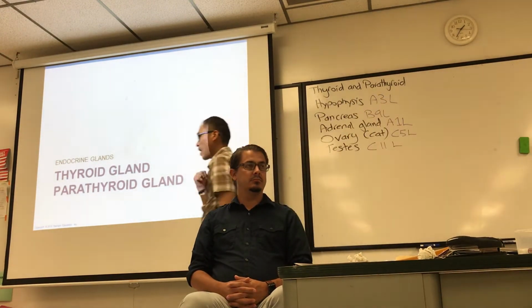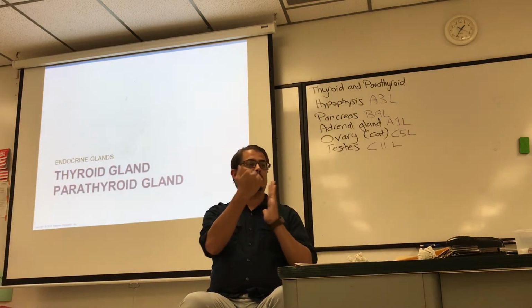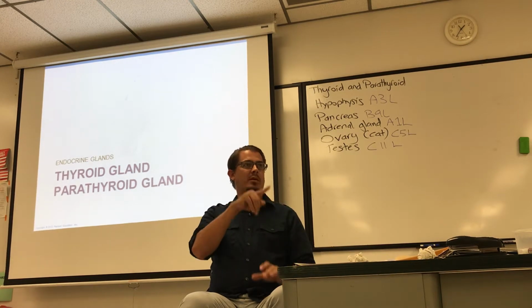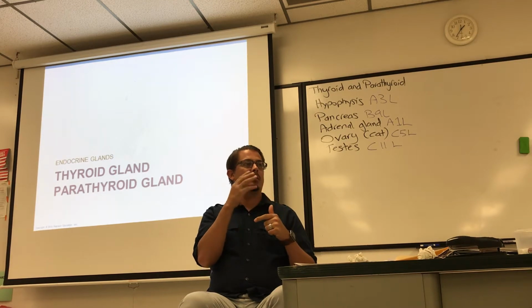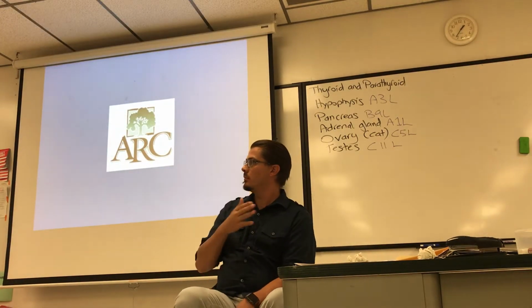Here's the thing. I got all the slides I'm going to go through listed on the board. You have the list of things. And pretty much when I give a quiz, I just take from that list, and I'll have you identify from the slides I'm about to take. So what I'm going to do, I'm going to get rid of this. I'll show you my microscope app here.